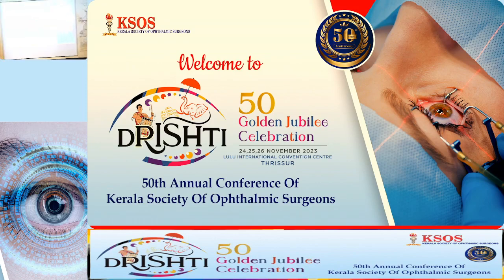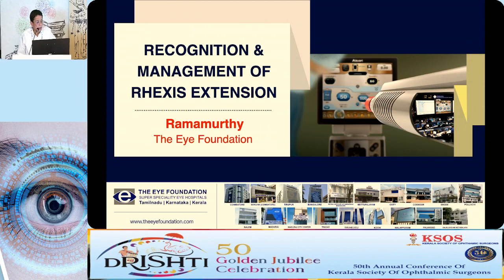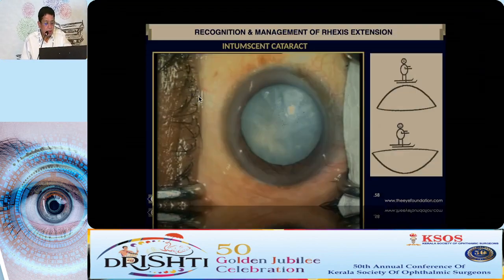Thank you so much, Dr. Sandhya, and thanks KSOS for this wonderful opportunity. This is a topic given to me. Let me try to illustrate the points I want to make with the help of some practical videos.